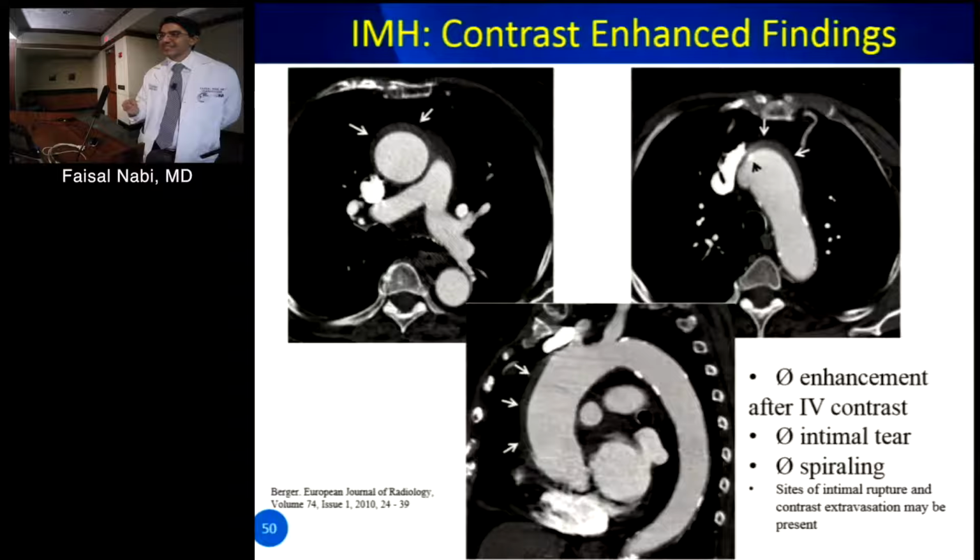Well, yeah, but mural thrombus is on the inside, because it's inside the lumen. But what you say, I'm assuming, is that you have seen something that is outside. You see outside, and it's this thickening that you see, and yeah, I get nervous. Sometimes you can have aortitis. I've seen some cases that are amazing.